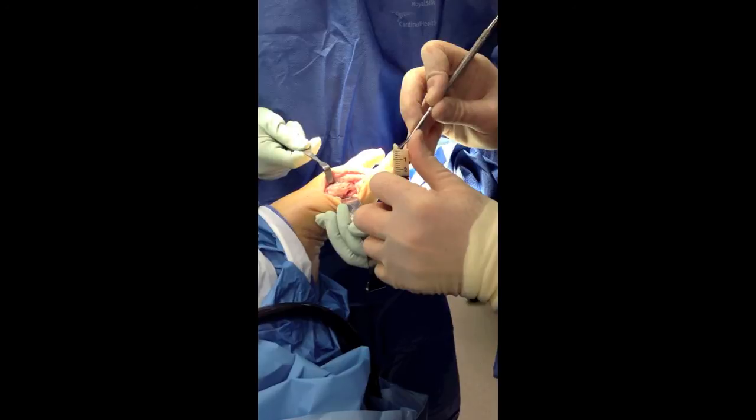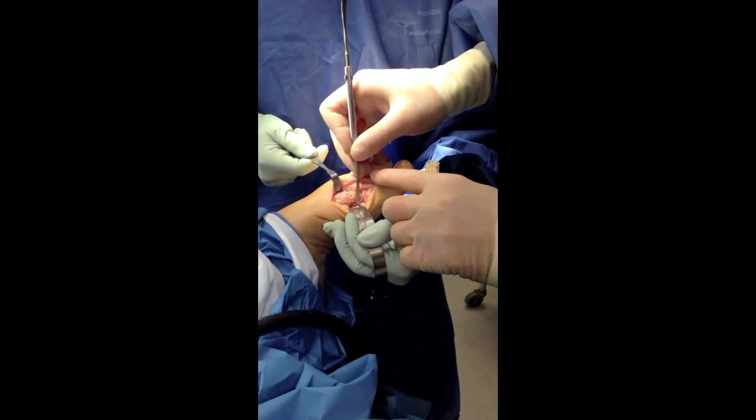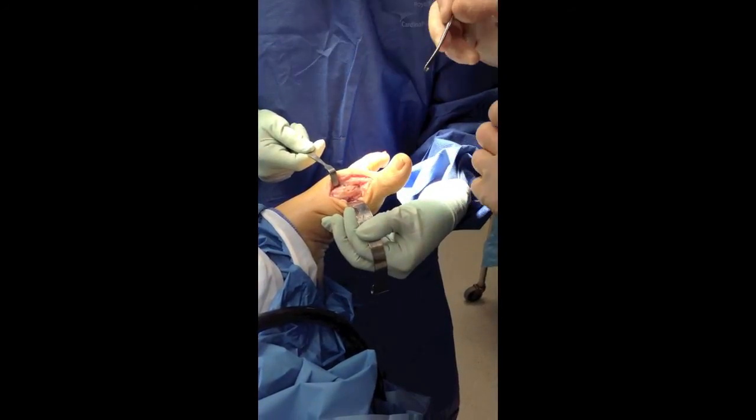So it fills in quite nicely. Look at that. Voila — all filled in.